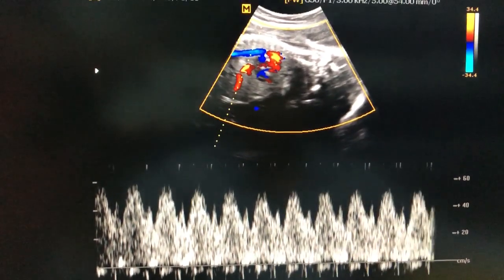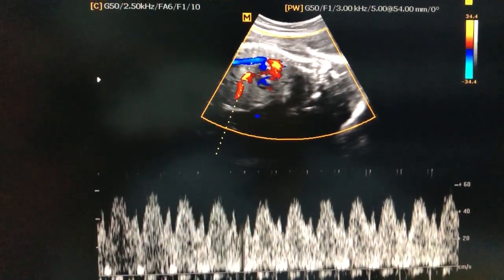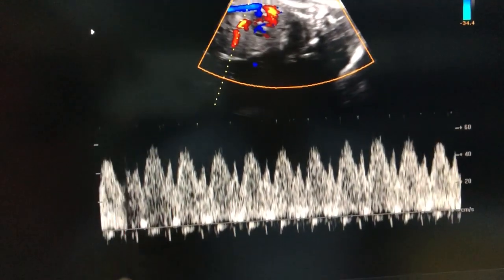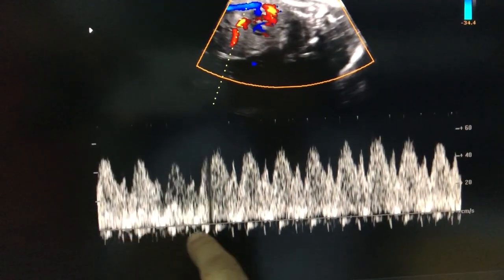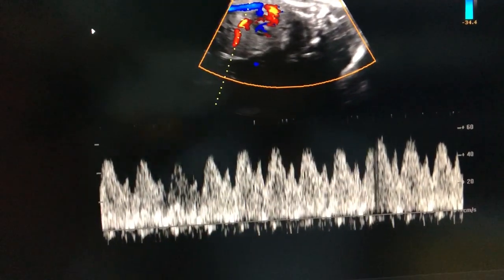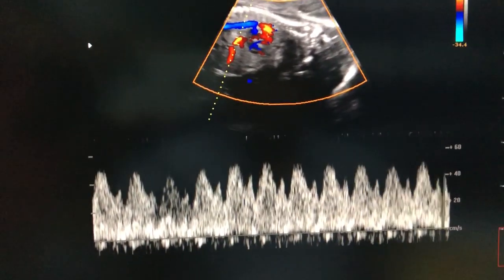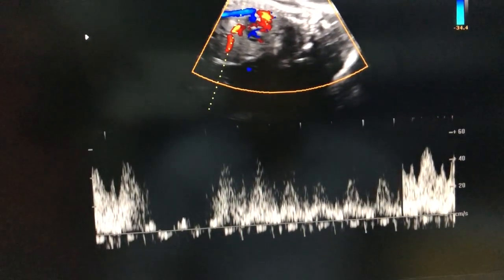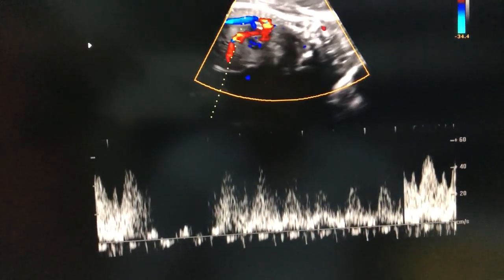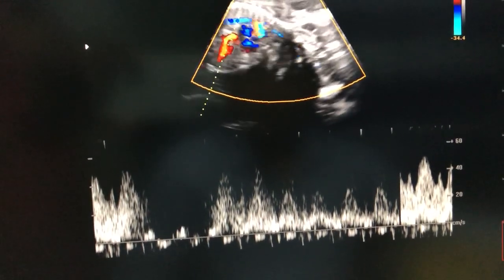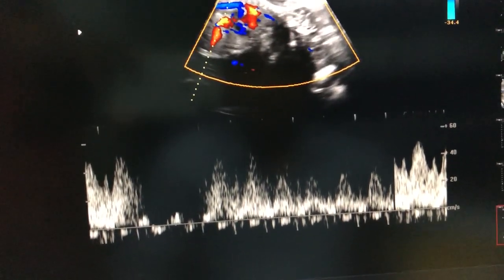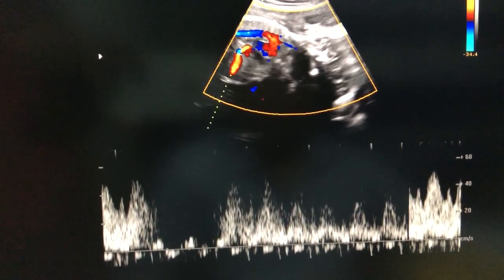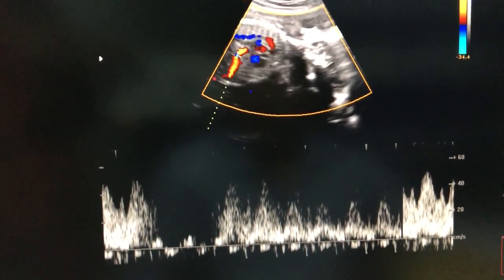This is the typical ductus venosus flow. Ignore these waves seen at the baseline — these are contamination. This is the ideal waveform of the ductus venosus. We will try to catch the perfect waveform if possible.